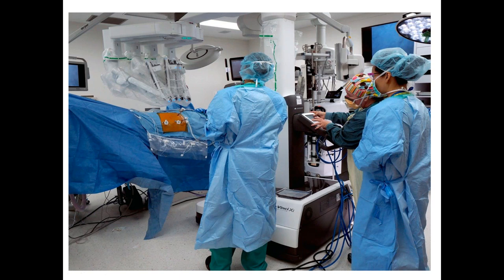When you're trying to push it into the abdomen after giving a skin incision, skin is something which cannot be pierced by any instrument except a blade. So once you give it a nick, you should be able to put this assembly of cannula and trocar together, and then take out the central trocar and put in an instrument. So these are the different ports you can see, and the person's trying to operate on that side. I do not know where the head is.